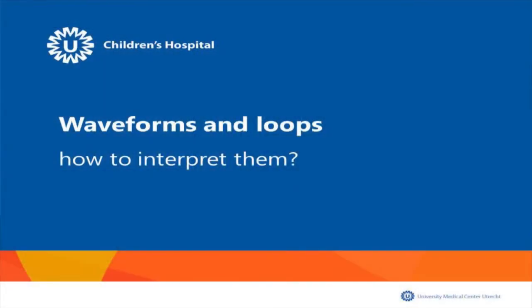The next subject is waveforms and loops. Tomorrow I asked you who is working with waveforms and loops, and about 5 people raised their hand. What are the other people doing? You never look at waveforms and loops, because they are on your screen. Don't you know how to use them, or aren't they on your screen?